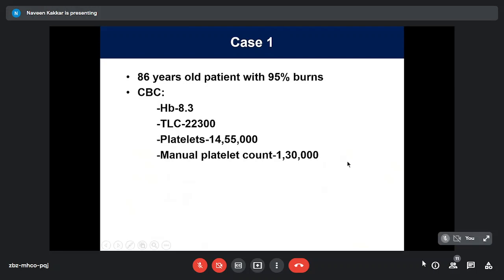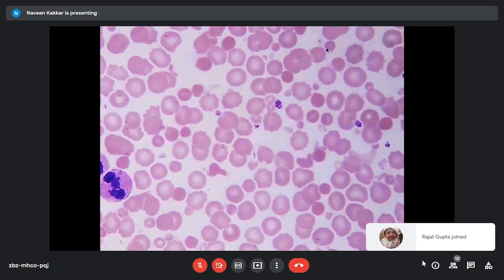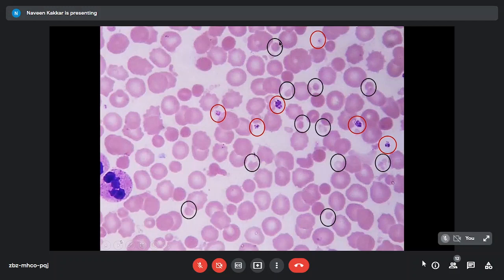But the manual platelet count was 1,30,000. That's what the smear showed. You can see the platelets here, 1, 2, 3, 4, 5 there. There's one here faded. So these are our platelets in red circles. But if you look in the background, there are small particles of the color of red cells, but very, very small, and smaller volumes are actually matching the platelet volumes. There they are. There are many more that are not marked. So you have red cell fragments, some budded off fragments, some elongated, some spherical, some almost spherocytic, which are of the platelet size. What had happened?